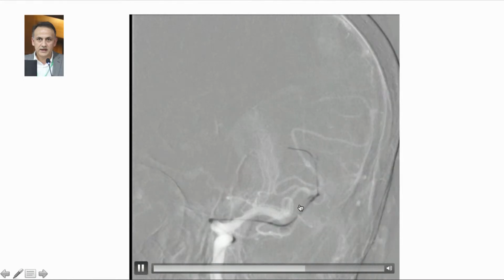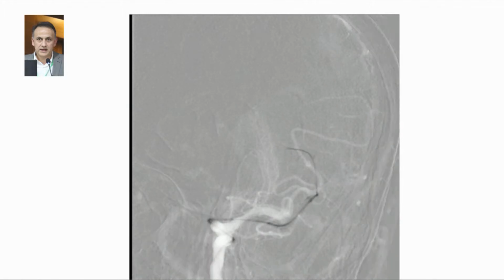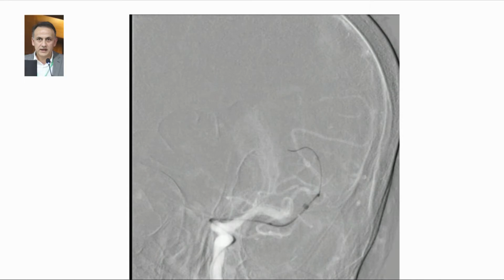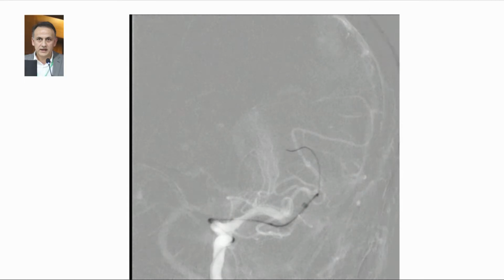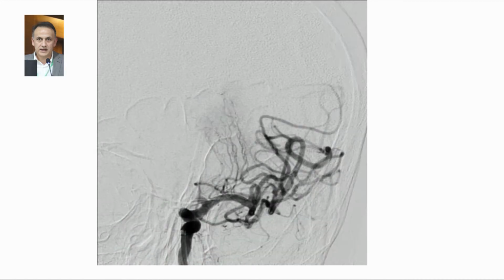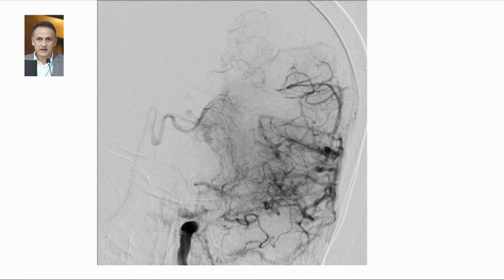We insert this by crossing the thrombus, as Adnan Siddiqui suggested, and then we use the thrombus aspiration catheter as well as the stent retriever, both. After aspiration and embolectomy, we had a nice result actually, but we also have an occluded anterior cerebral artery, as you see here.